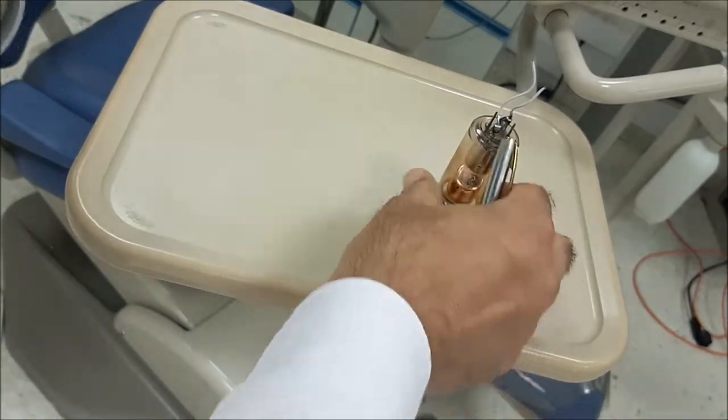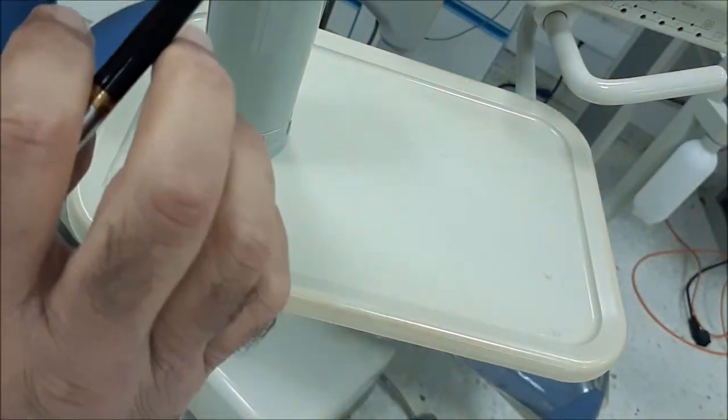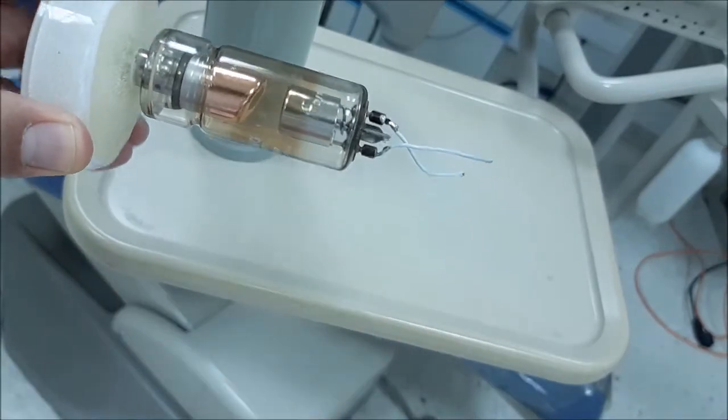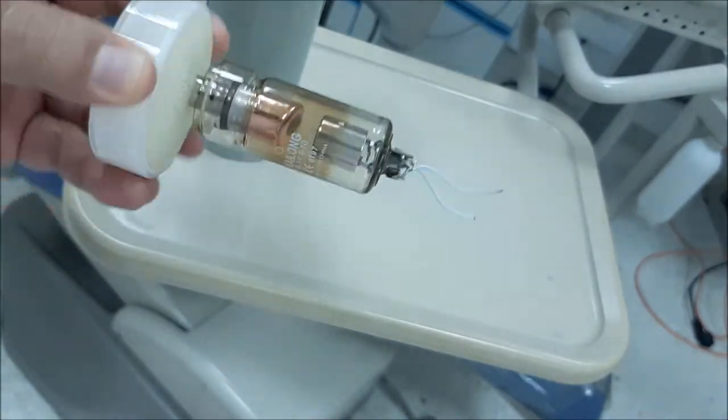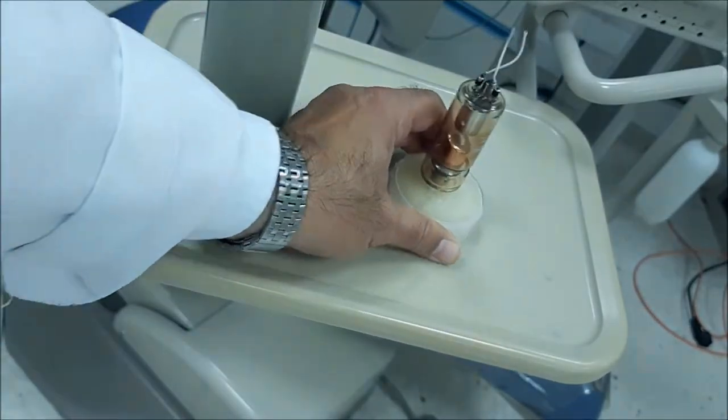When the x-ray is generated, it will be directed relatively through one area by the angulation of the anode, and it will be emitted through the window.